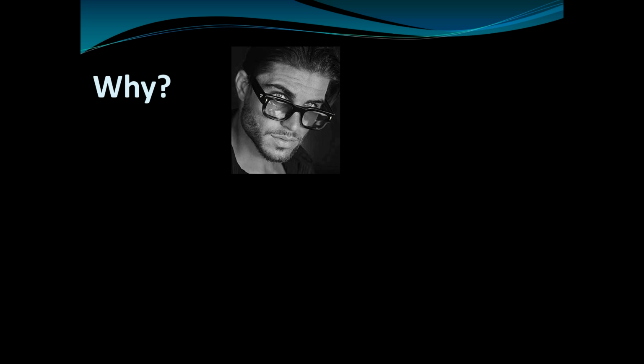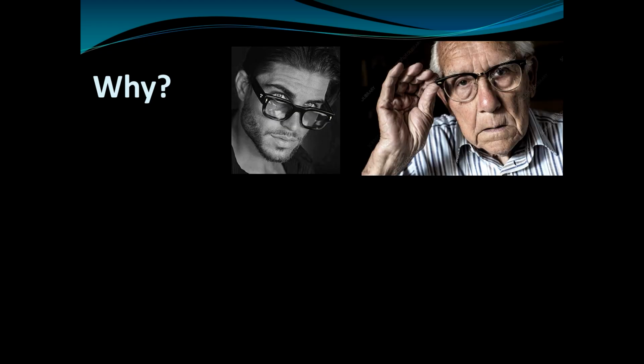You have someone with a high degree of myopia. They come in and have loss of vision completely in one eye or just part of one eye, and you can't really tell what's going on. Even if you have your fancy ophthalmoscope, it might actually be easier to look with ultrasound. You have a 64-year-old guy who comes in and suddenly has all of these floaters and a history of diabetes. What's causing the floaters? This you can actually see by ultrasound.